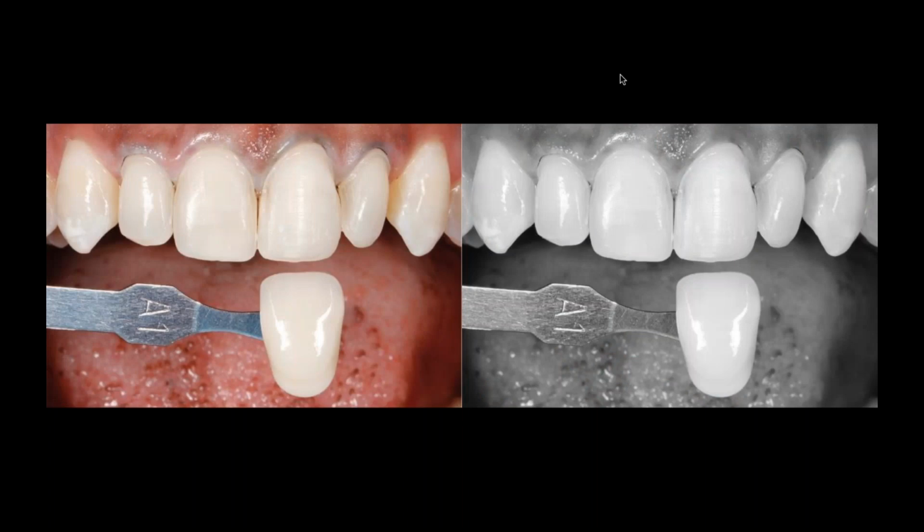When we use such a highly translucent material like feldspathic ceramic, the color of the abutment tooth is very important to consider. In this case, you can see the color of the tooth once it's been prepped, and the prep is very minimal. Sometimes in these cases, you don't even need much anesthetic, or much provisionalization if it's just for a few hours or 1 or 2 days. But when we use highly translucent ceramics like VITA Trilux Forte, we need to evaluate the color of the abutment and be critical about it.